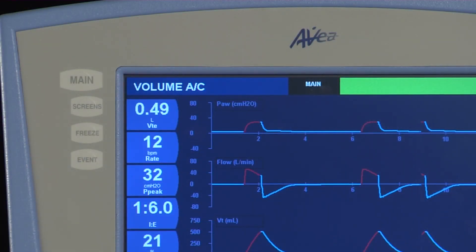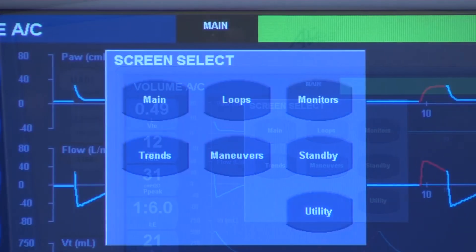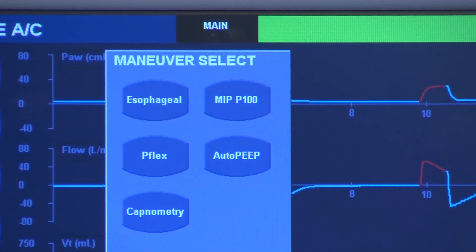When preparing the ventilator for transpulmonary pressure monitoring, you must access the esophageal maneuvers screen by selecting Screens, then Maneuvers, then Esophageal.